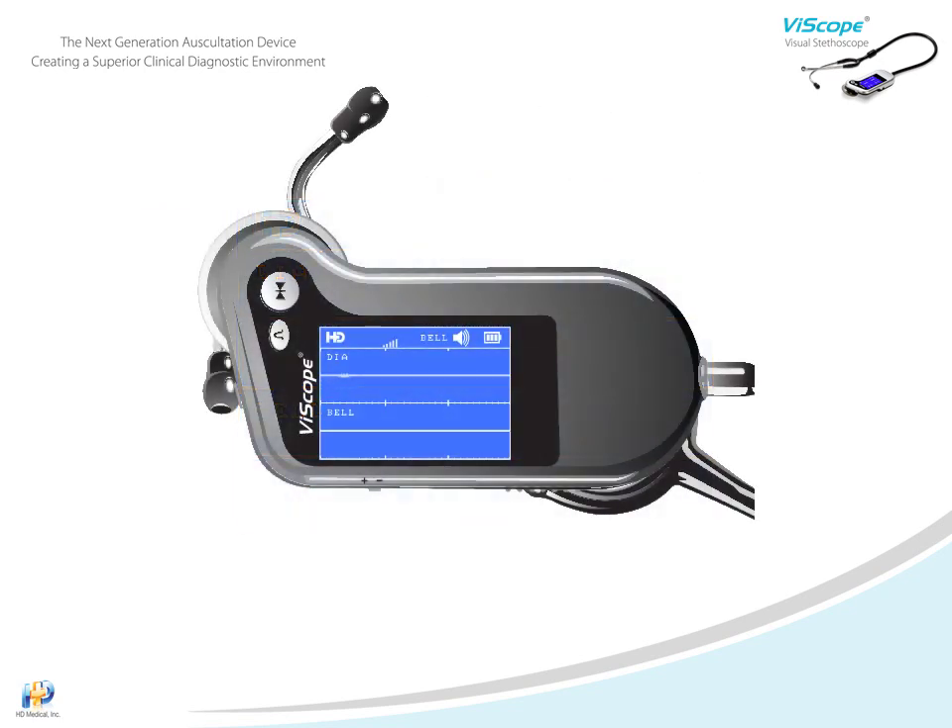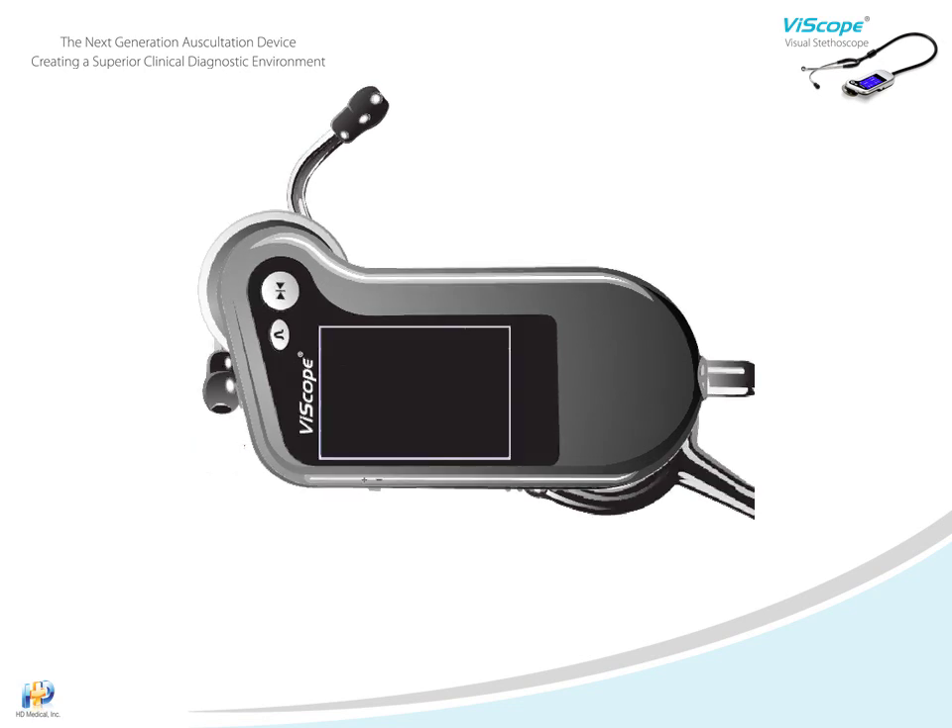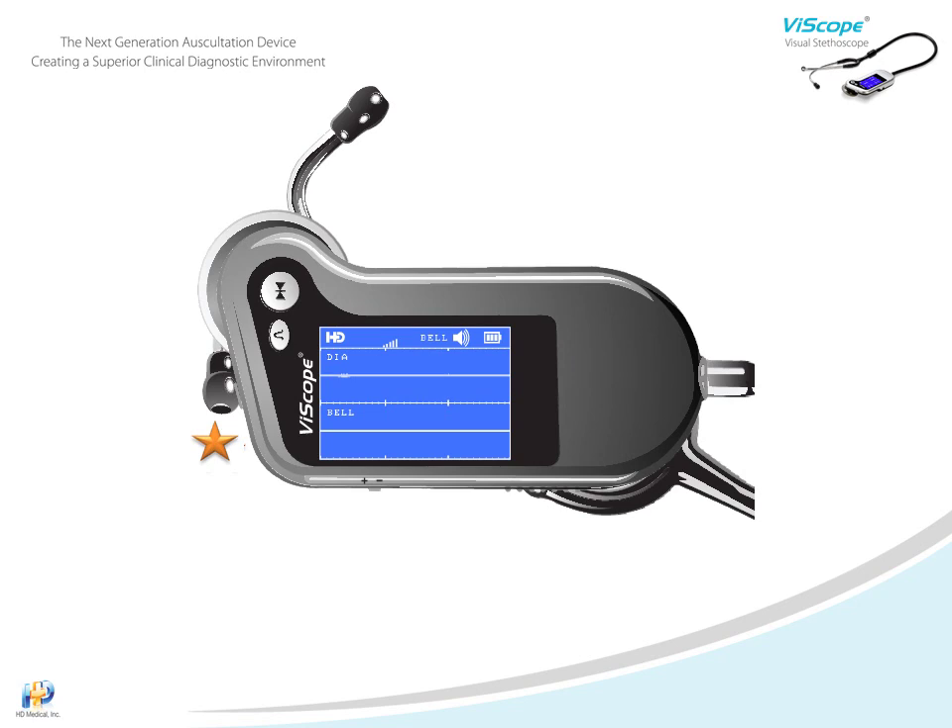The Viascope has several power-saving features. For example, when not in use, you can turn the backlight off by tapping the power key. If it senses it hasn't been used for three minutes, the display automatically turns off, and after six minutes it will enter into a standby mode. To turn back on, press and hold the power key for three seconds.